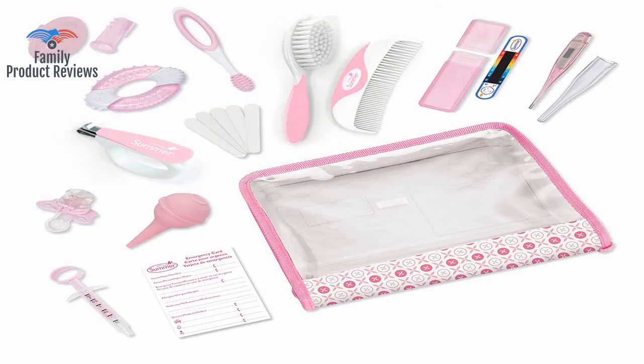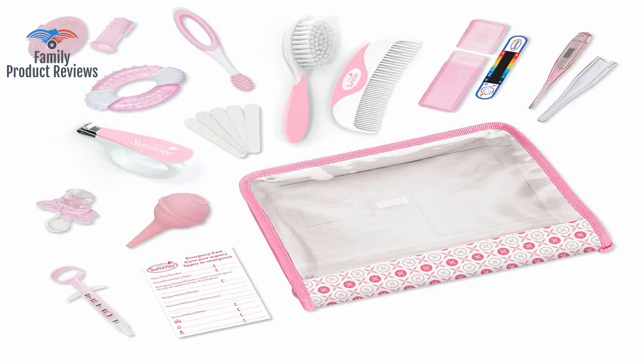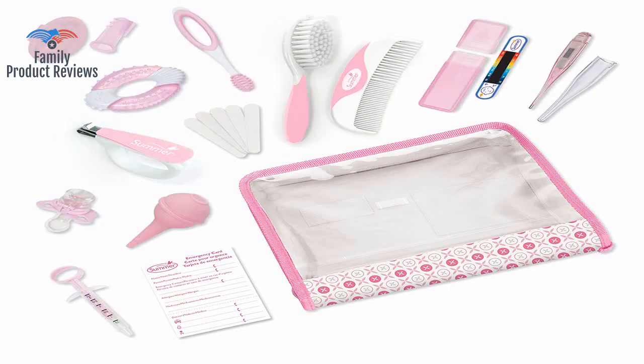The thermometer takes forever to read, but the rest of the products are great. The thermometer is super important though, and for a newborn the faster the better. The case they come in also has plastic inserts that keep them all neatly separated.